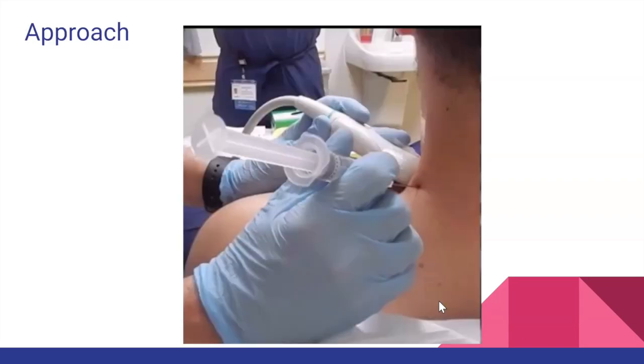Oh, and it's going to be 10 to 15 mLs of volume that you're injecting. You're always going to have to figure out your weight-based dosing. For this block, because it's a procedural block and because you have the potential side effect on the diaphragm, you want to be using lidocaine, not bupivacaine. You don't want a longer-acting anesthetic in this case, because you just need to get the procedure done and move on. So figure out your weight-based dosing for lidocaine. Unless the person is very small, it's most likely going to be at least 10 to 15 mLs, and then you can put that entire volume into the block. I only did 5 cc's on you and it's already working, so that's pretty cool.